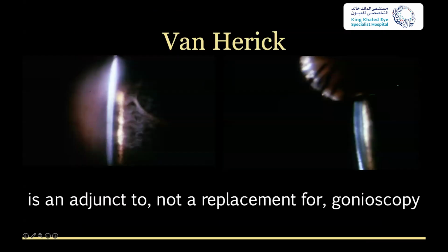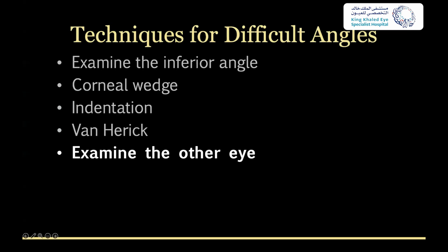So again, it's an adjunct to, it does not replace gonioscopy, but it's a useful tool. And I think I do it on every patient when I'm doing my slit lamp exam, just that's how I'm wired. The other really useful tool is look at the other eye.